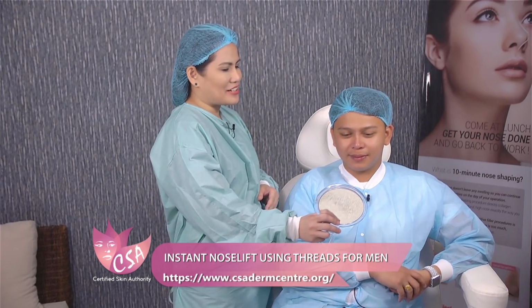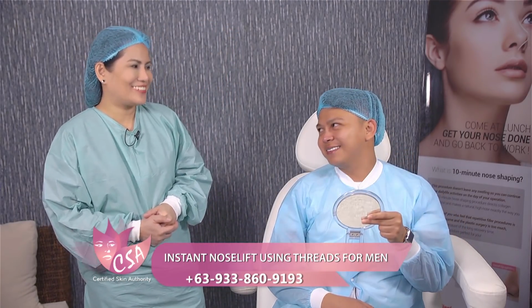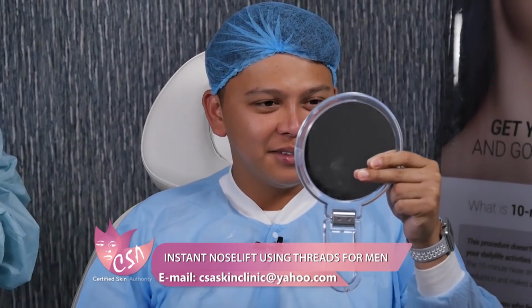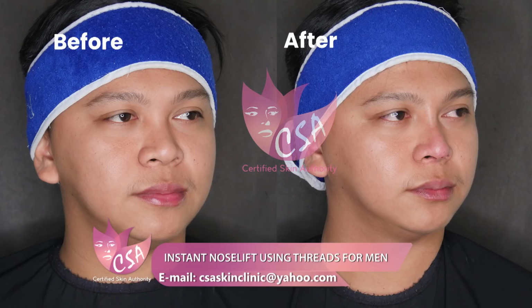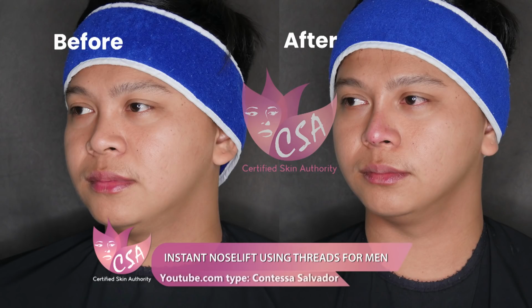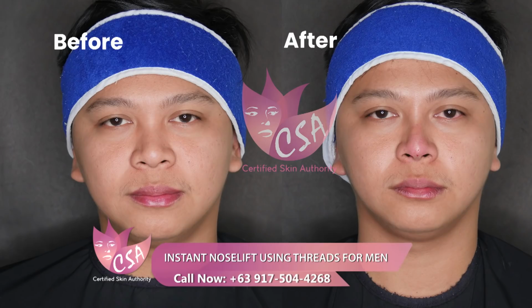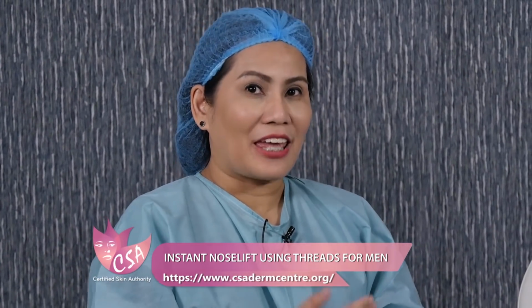Okay, Neil, here's our mirror. Okay, you can hold on to this, right? Yeah. So, noticeable result, instant result, natural result. Yan. Sobra naman, Doc. Ang ganda. Right? So, we have achieved our goal of elevating the nasal bridge and projecting the nasal tip. Nung na-project natin yung nasal tip, nasama yung sides, yung alars. Nag-narrow din yung alars ni Neil. Right? Yes. Yan. And later on, I'll add yung botox na rin para sa alars niya to relax yung muscles na nagwa-widen ng kanyang alars or to reduce the alar flaring.